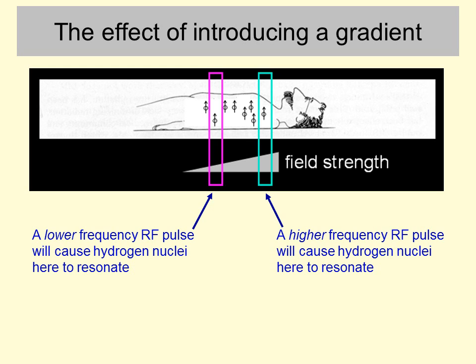So then we know, because we transmit at a certain frequency, where in the body that frequency can be absorbed, but at other points in the body it can't be absorbed. So then when we move the RF coil into receiver mode, it can only be receiving current from a particular location in the body, and that's how we know, in principle at least, where the signal is coming from in the body.